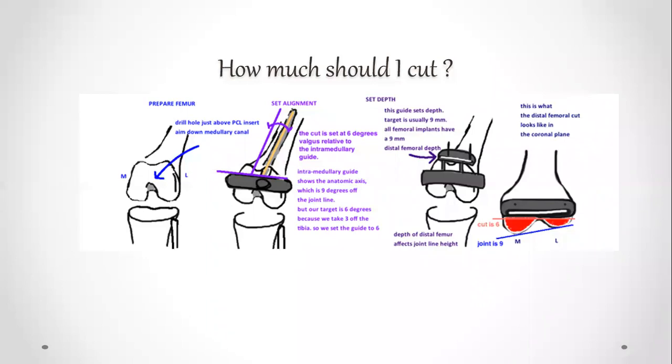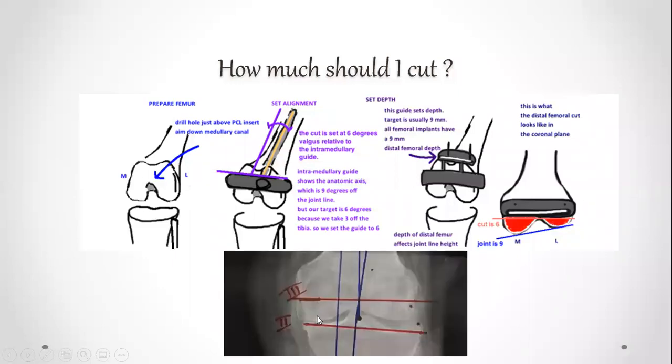When we ask the manufacturer, the assistant manufacturer will put it in 6. This 6 is what we said here is the angle. And then the distal cut is 0. 0 means we take 9 millimeter from the medial condyle of the femur. Okay, and this represents the width of the component, the femoral component, later after we put the component inside. So that's why in this picture you can see number 3, this distal femoral cut here is 9 millimeter from the lower edge of the medial condyle.